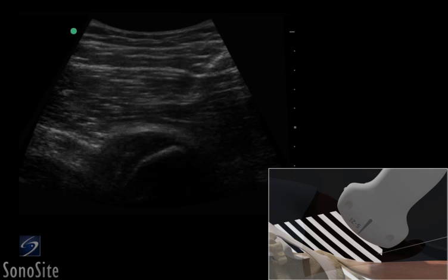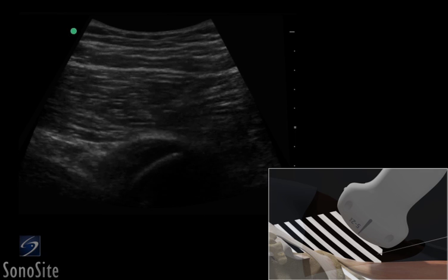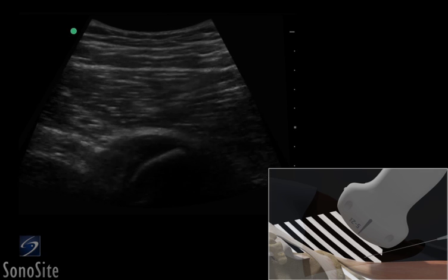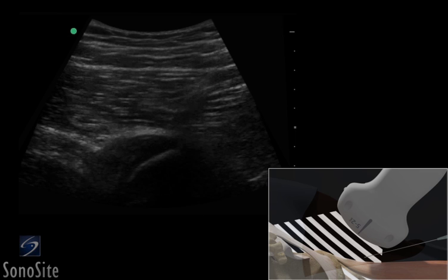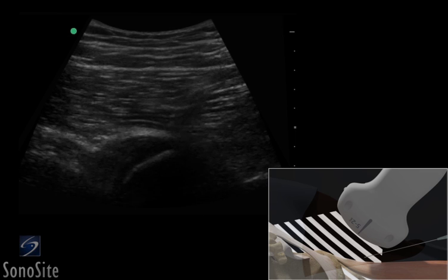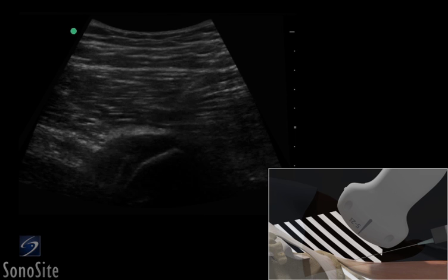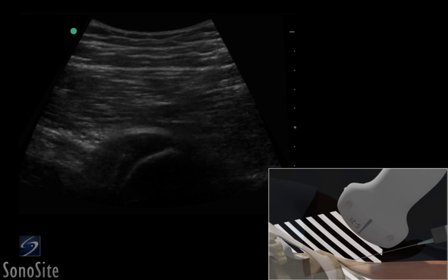The needle is inserted in a long-axis approach lateral to the transducer. The needle is slowly advanced to lie in plane to the transducer beam and is seen as a bright, hyperechoic, linear structure. The needle is slowly advanced under direct ultrasound visualization until the tip is seen to puncture the anterior surface of the muscle. The needle should be advanced until the needle tip lies just above the bony surface within the conjoined tendon.